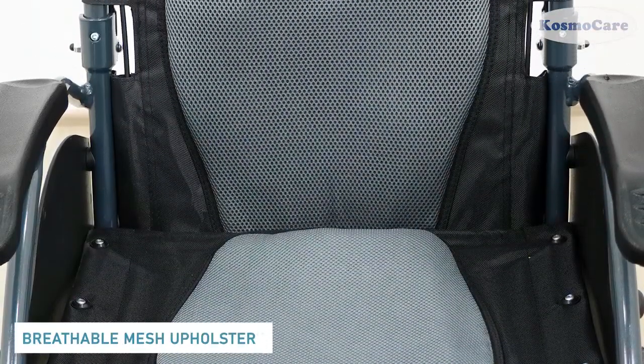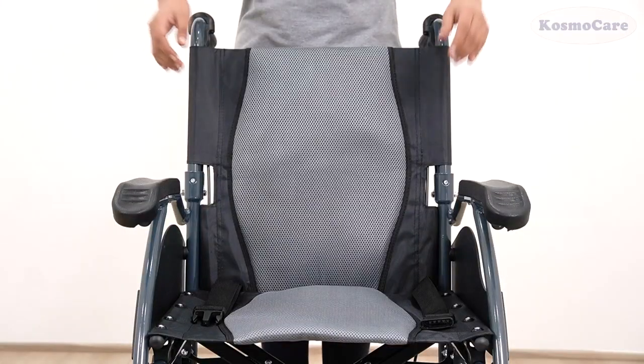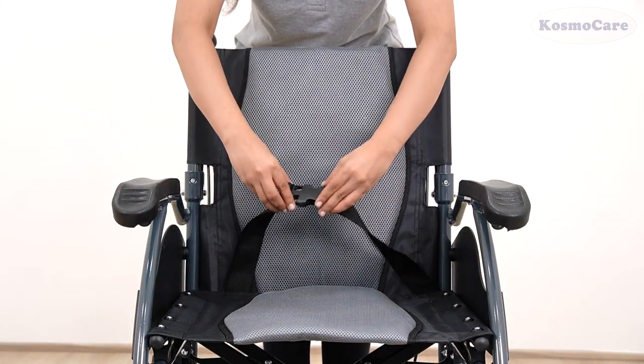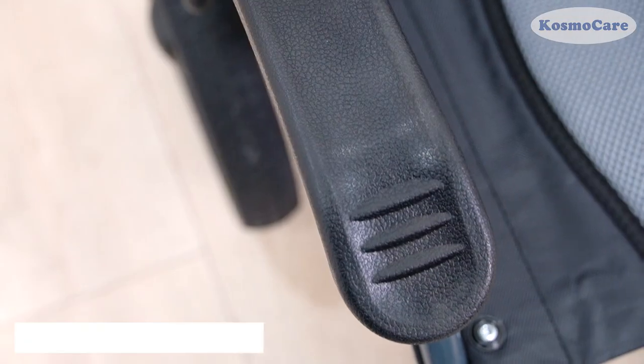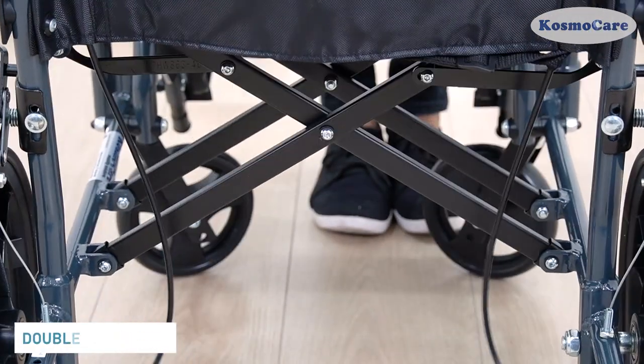The seat is upholstered in a comfortable mesh fabric that is water-resistant and also breathable, and the built-in seat belt enhances user safety. Waterproof PU arm pads are extremely durable. The double cross bar adds extra strength to the wheelchair.